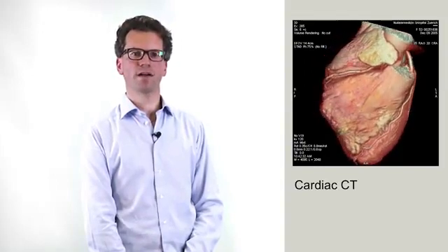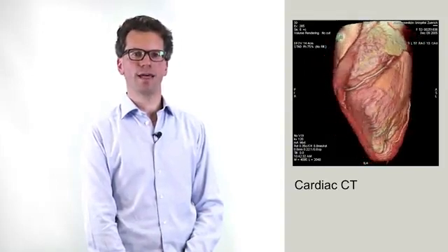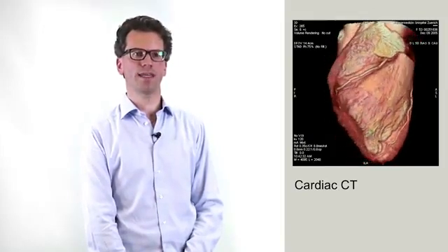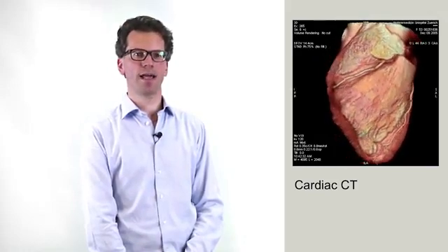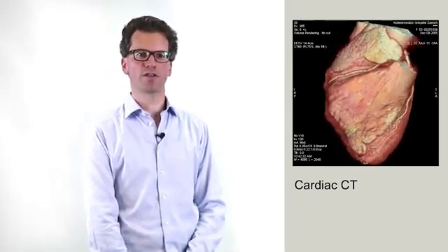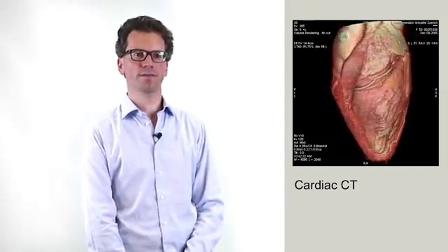Over recent years, cardiac CT has been developed and also offers a very nice method to assess the coronary arteries, even look inside and show plaques themselves. It can also assess the myocardium, the wall motion of the myocardium, and other structures of the heart, such as heart valves. It can also show pathological contents of the heart, such as, for example, tumors in the heart chambers or thrombi. Not only the heart can be imaged, but also adjacent structures such as the aorta or the pulmonary artery.